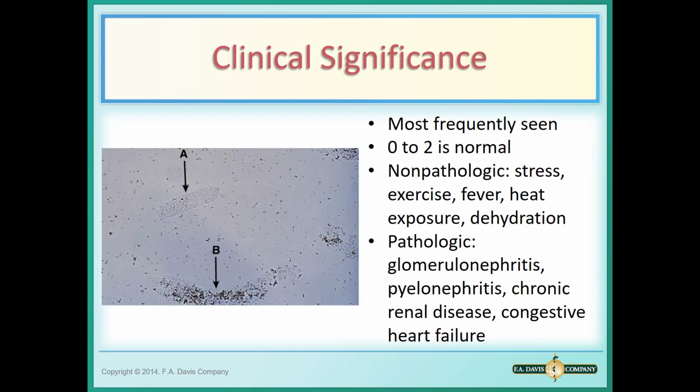Normally, we can see a couple. There's very little to it. This has a little more schmutz in it, but it's still a hyaline cast. This isn't a granular cast.